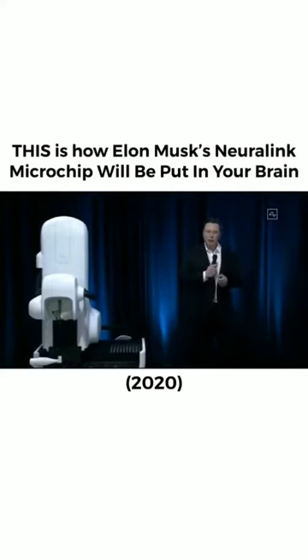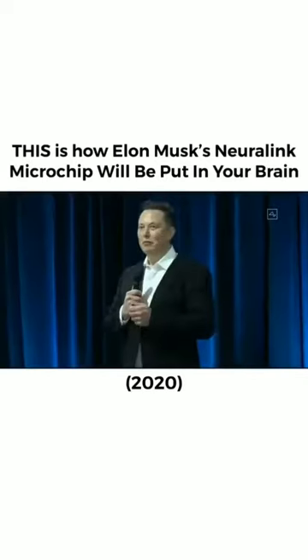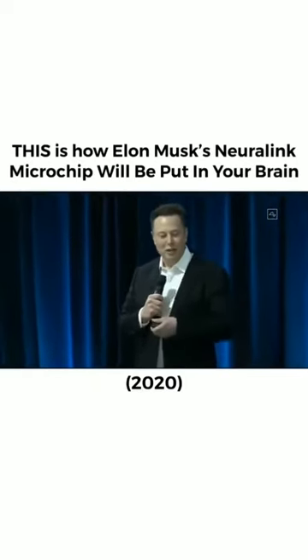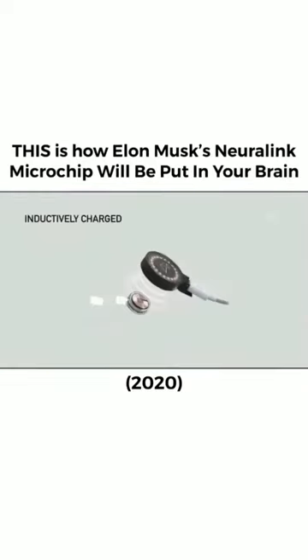It's also got all the sensors you'd expect to see in a smartwatch or a phone, like inertial measurement, temperature, pressure. So there's actually a lot of functions that this device could do related to monitoring your health and warning you about a possible heart attack or stroke or other damage, as well as convenience features like playing music. It's sort of like if your phone went in your brain or something. Yeah, maybe that's not a great analogy. Anyway, it's also inductively charged, in the same way that you charge a smartwatch or a phone.